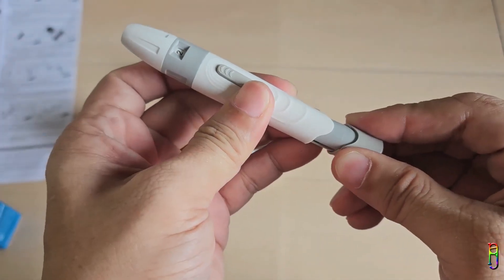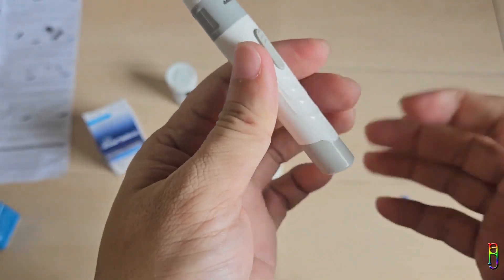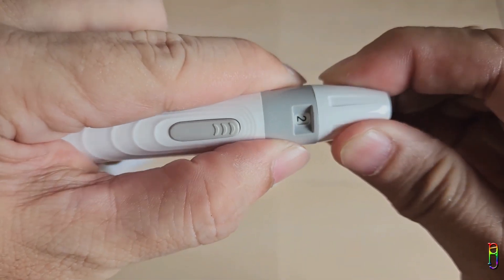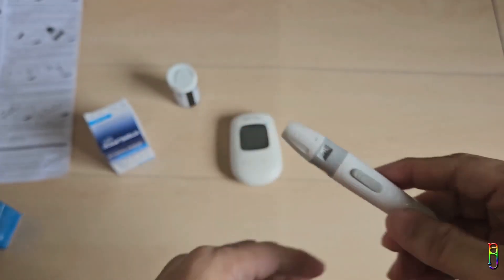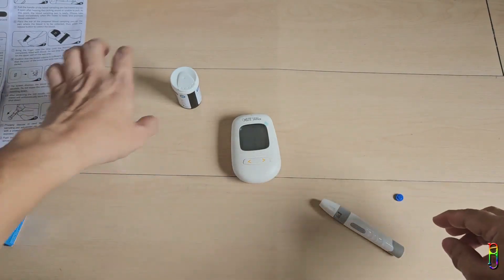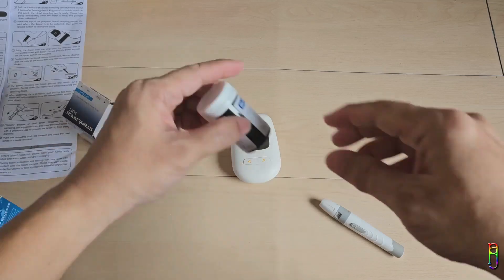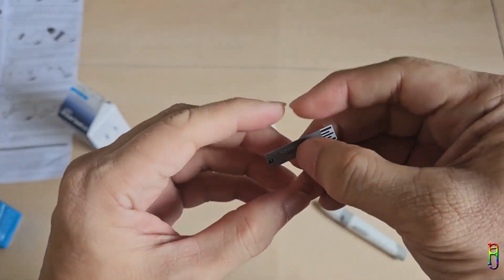Usually when you push the lancet into the lancing device it is already cocked; if not, just pull the back of the lancing device until you hear a click — like cocking a gun, readying it to prick your finger. You can adjust the pricking length from one to five. For me and my wife we only use number two, since number three or higher pricks deeper and hurts. This will depend on how thick your skin is. The longer pull-out button is the ejector for the lancet.